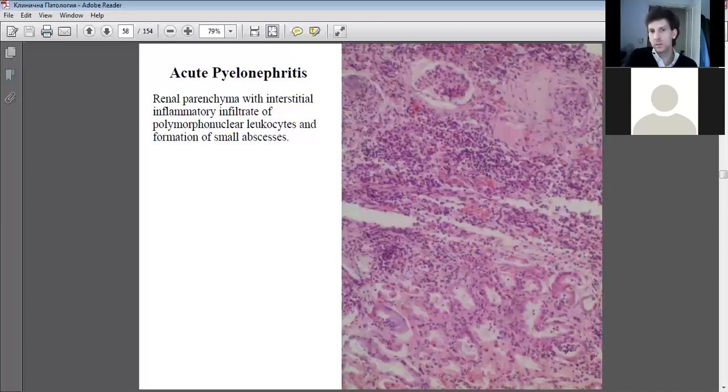Again, a similar example of inflammation. This is massively inflamed though. This area here is hugely inflamed. All this is the leukocytes, inflammatory infiltrates. Some normal tubules towards the bottom here. Fairly normal, but the Bowman's capsule is beginning to degrade, because there's a shrinkage of the capillaries as well.